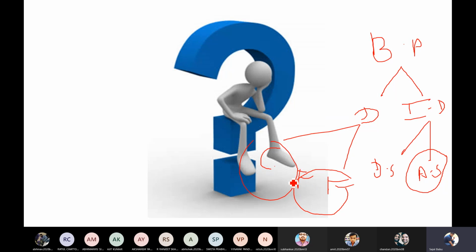Okay, so among these, which is more advantageous? The catheter tip, because the sensor is in direct contact with the blood and directly converts the reading, so it can easily measure the dynamic changes in the blood pressure. But the fluid filled type may not measure dynamic changes as fast as the catheter tip type, because of the fluid friction here.